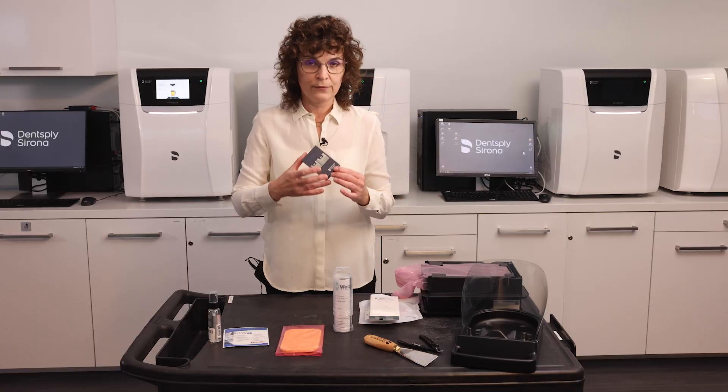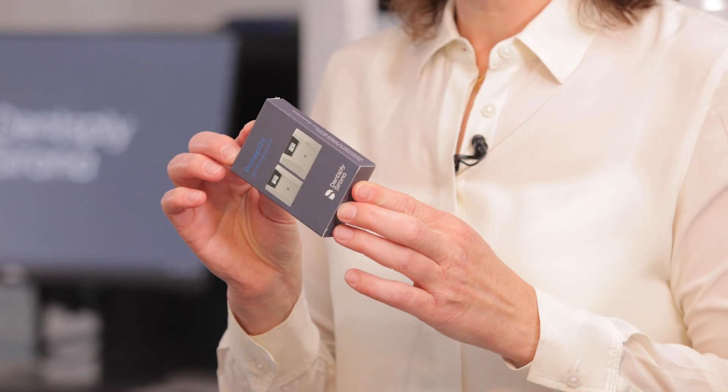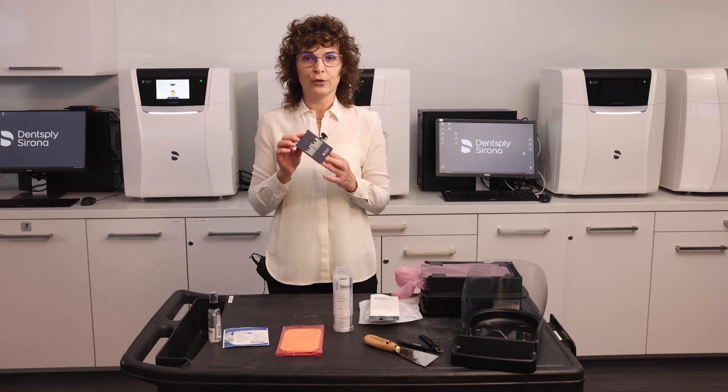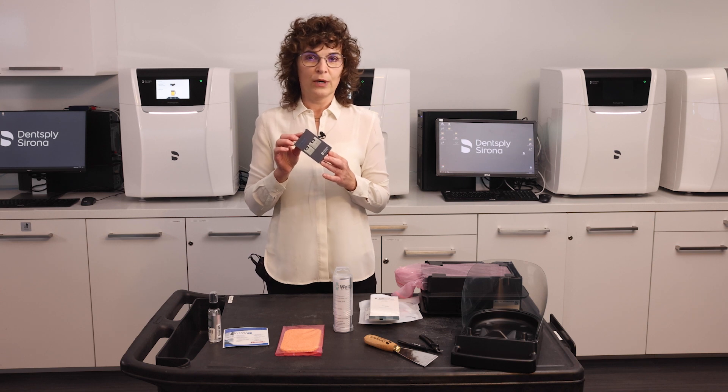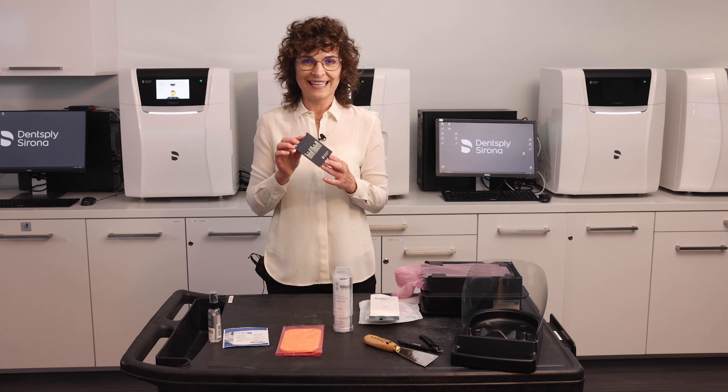Additionally, we give you a deck of Dentsply Sirona playing cards. We usually get a question: why do you give us cards? The cards are used to remove a cleaning layer from your material unit when one needs to be printed. Again, we have a video that shows how to do this step exactly.